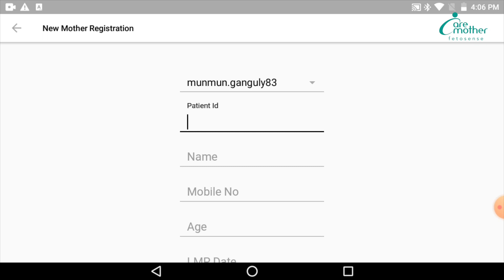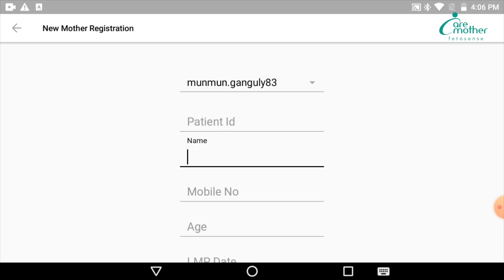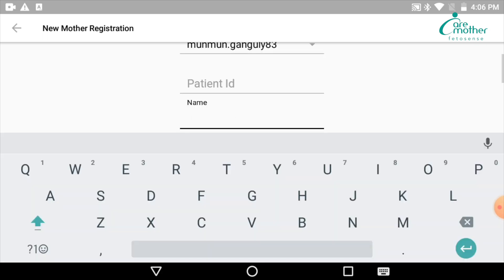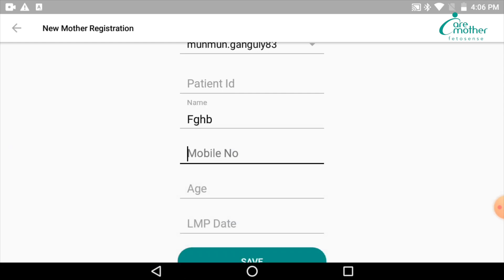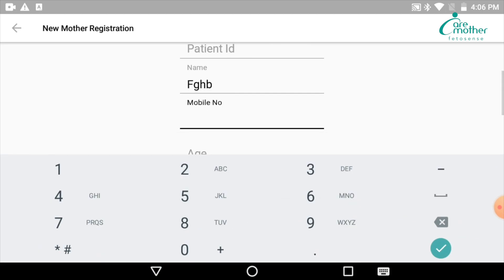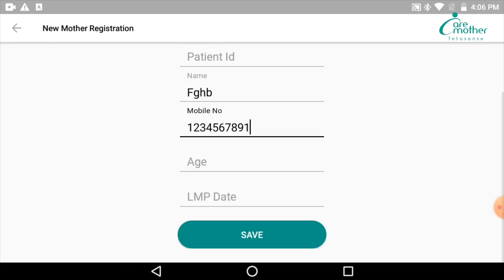The next thing we enter is the patient's name. After the patient's name, we will put in their mobile number. Make sure that the mobile number is correct, or else you will have to counter-check it while saving the data.